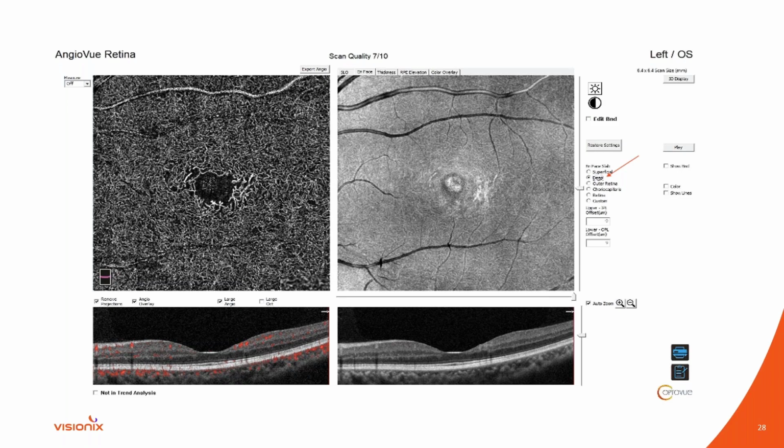You ask yourself, what if? Having this amount of capillary outpouching, remember that microaneurysms are the first sign of damage in the eye. Having this amount of damage is going to lead to progression of changes fairly rapidly. So understanding that this exists and really calling attention to it, and you can see here that it's not proliferative, it was extremely helpful to us.